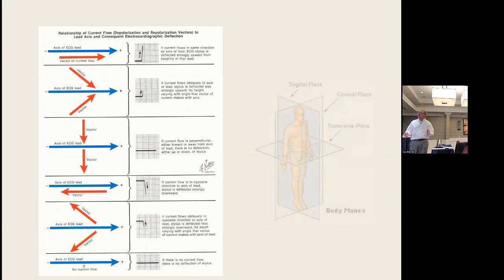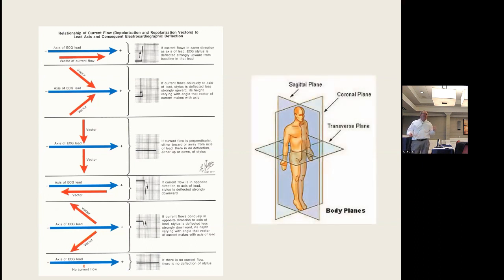And the reason I say this is because it makes sense when you start to look at the leads and the way they're positioned around the heart. We're going to look at body planes.